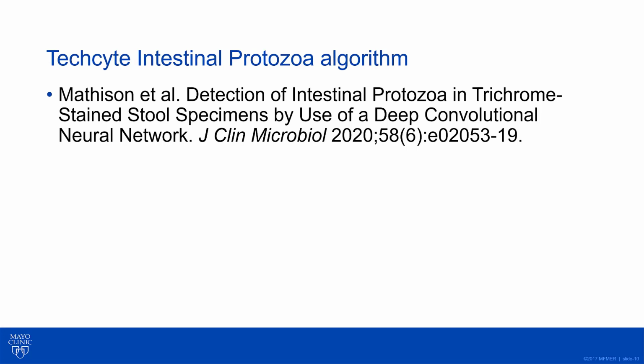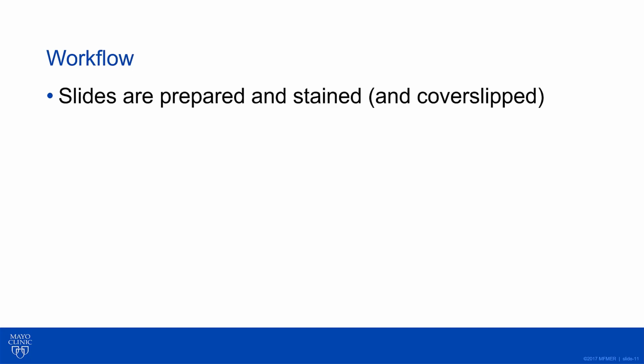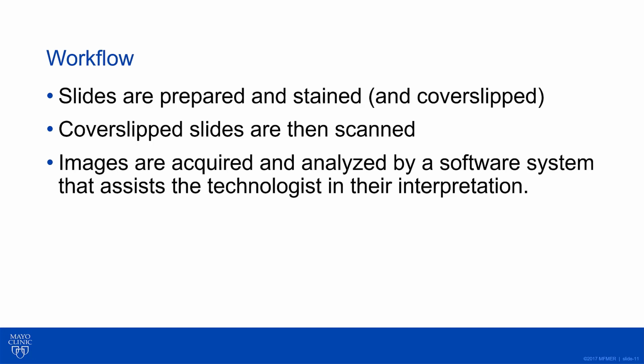So this is a commercially developed system, and we decided to bring it in and validate it as a laboratory developed test in our laboratory. The workflow for this algorithm requires slides to be prepared and stained, and they have to be cover slipped with a permanent mounting medium. They are then scanned by the slide scanner, and images are acquired and analyzed by the software system, which assists but does not replace the technologist in making the final interpretation.